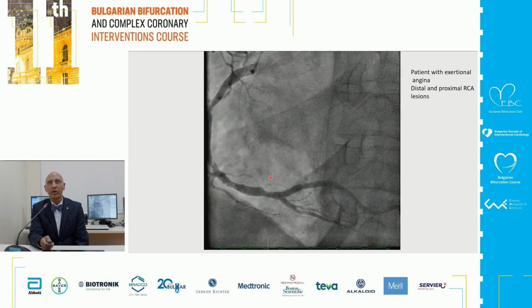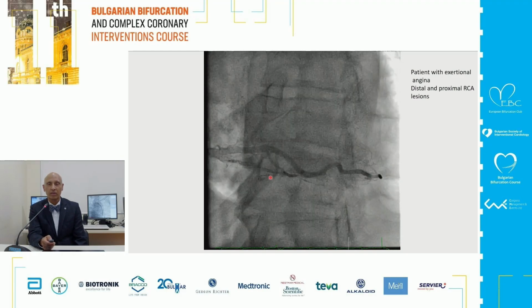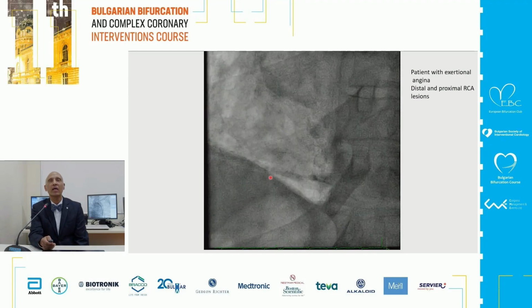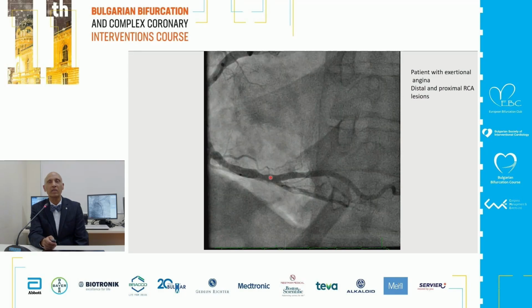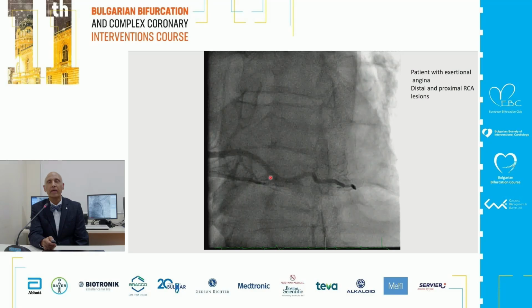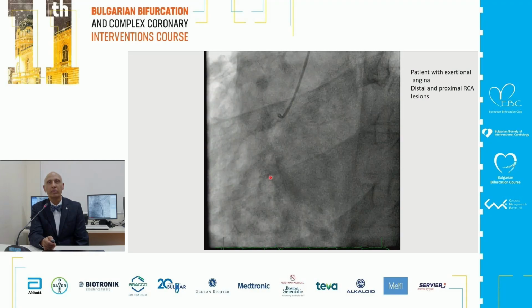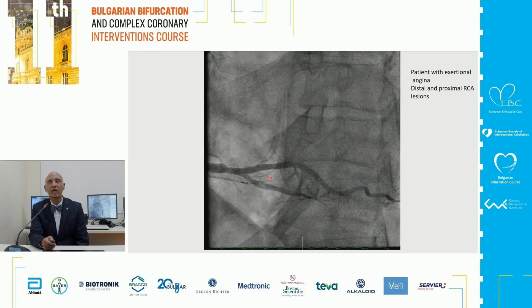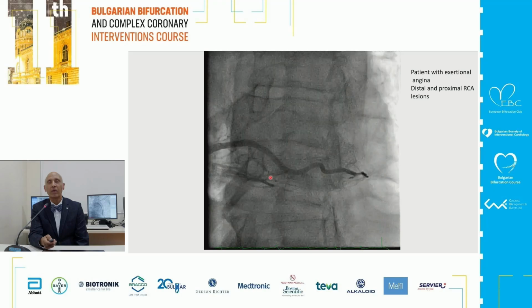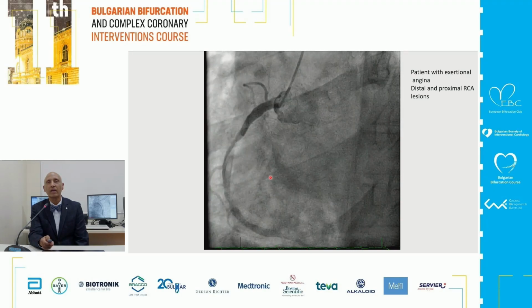What I would like to point out is that when you look at this dominant right coronary artery without any contrast, there apparently does not seem to be any calcification silhouetting the vessel. We often depend on that appearance to comment on whether the vessel is calcified or not. I would like to bring that up and discuss that point later.